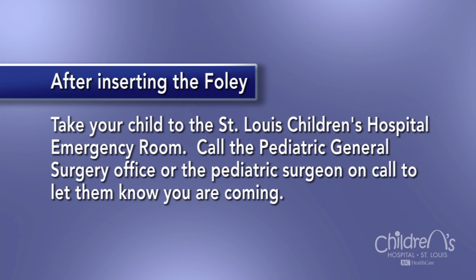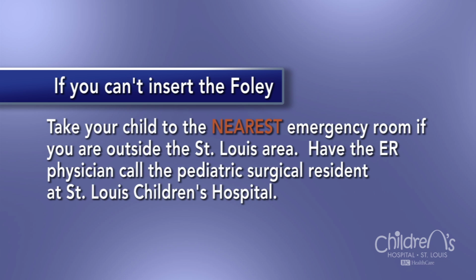You will need to take your child to St. Louis Children's Hospital emergency room. You should call the surgery office or the pediatric surgeon on call to notify the emergency room you are coming. If you are unable to insert the tube, take your child to your nearest emergency room if you live outside the metropolitan St. Louis area. Have the local emergency room physician call the surgical resident on call at St. Louis Children's Hospital. You can reach the surgery office 24 hours a day.